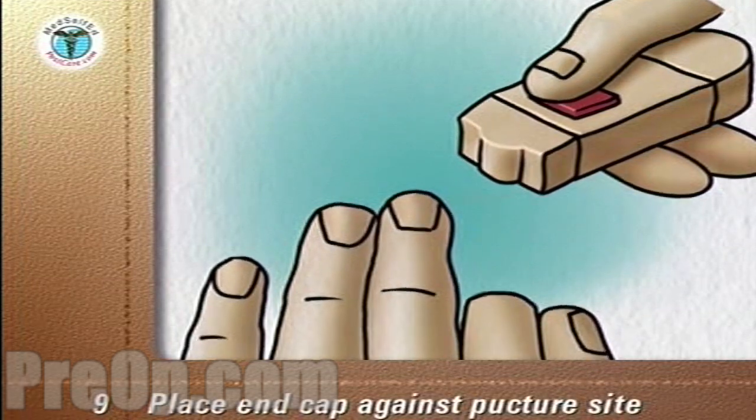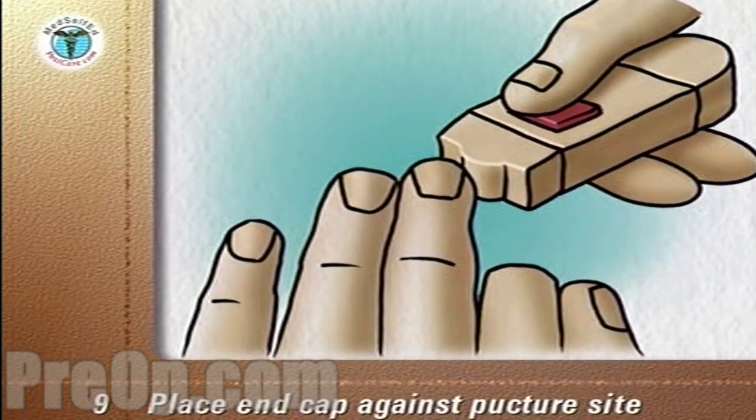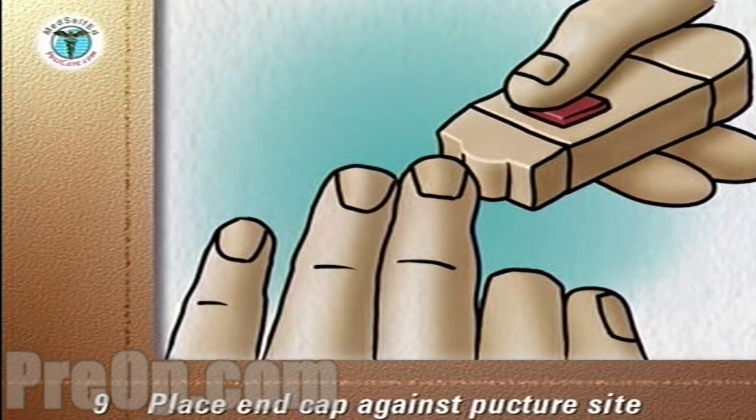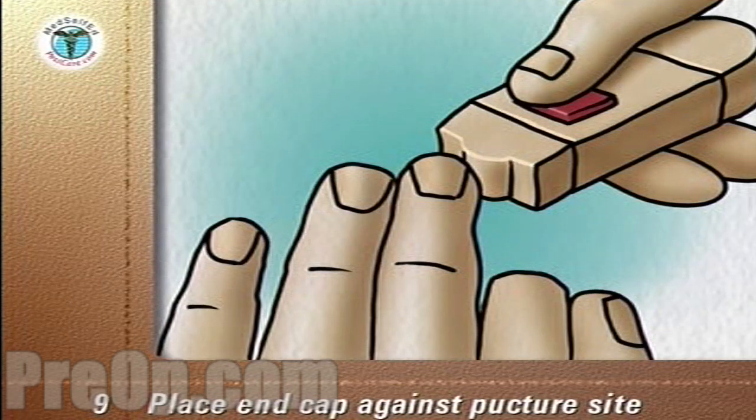Place the end cap firmly against the chosen puncture site on the side of the fingertip. The more pressure you use, the deeper the puncture. Push the lancet release button without moving your finger or the device.